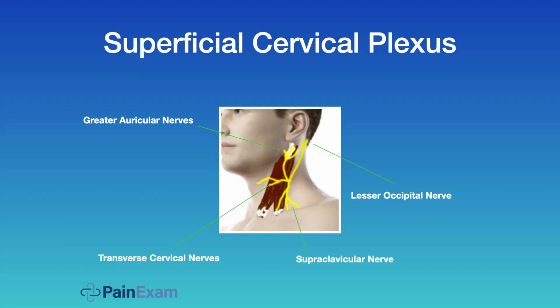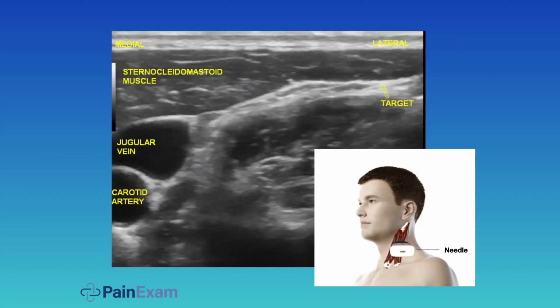Okay, this is a block I'll do just a couple times a year, but it's very useful, very safe to do. And keep it in mind for those clavicular fractures, especially if you're in the orthopedic office or in the emergency room. Okay, you want to find the sternocleidomastoid muscle, and you're just infiltrating 2 to 4 mLs of injectate right behind the muscle in this plane.